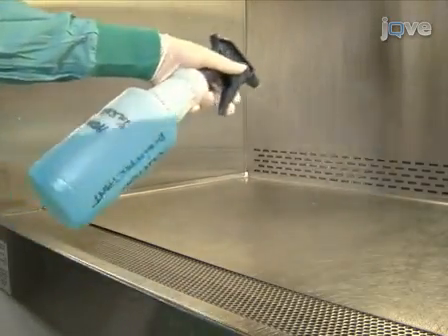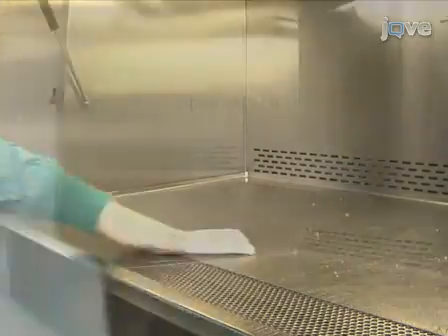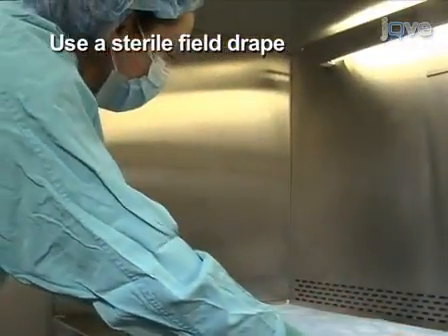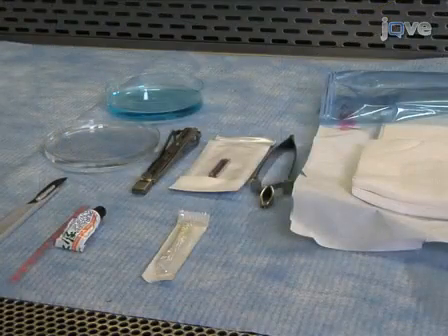To prepare the surgical area, spray all surfaces with 2% chlorhexidine disinfectant. Then, cover the surfaces with absorbent drapes. The following supplies should be placed in the surgical area.